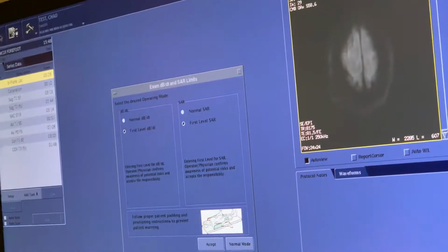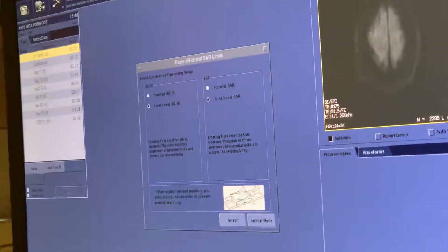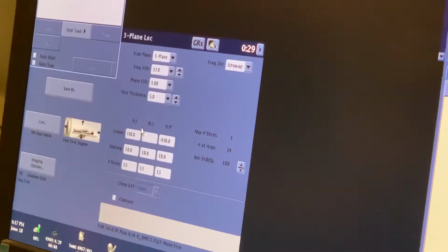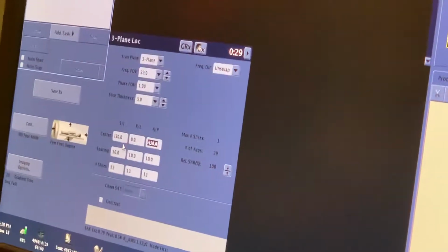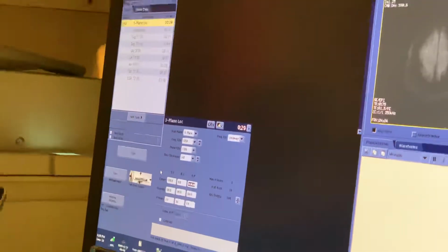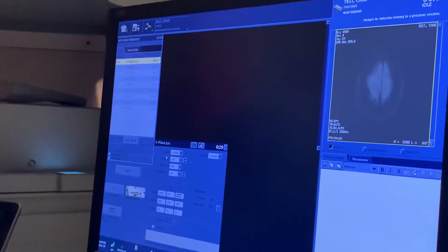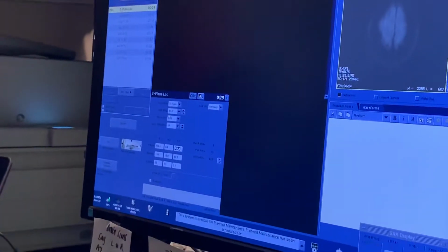Ooh, 35% power, huh? Okay, all right, so here we have the controls for the Scout, and if you see something, I know I put the coil directly in ISO center, so you see where it says R50. Well, I can just delete that and hit 0, so that I just get rid of that completely, okay? Because there's no sense having it centered to the left or the right if it's in the middle of the bore.